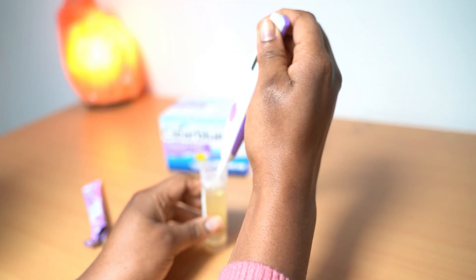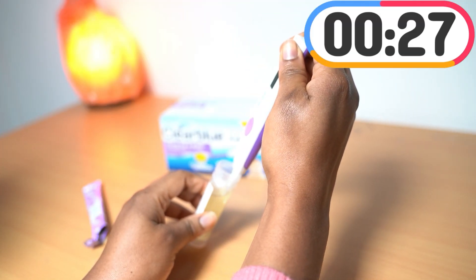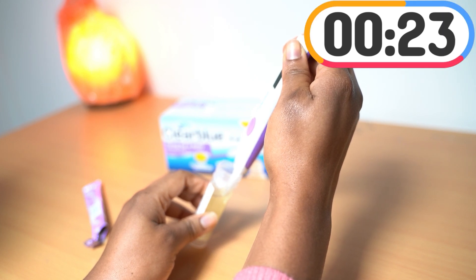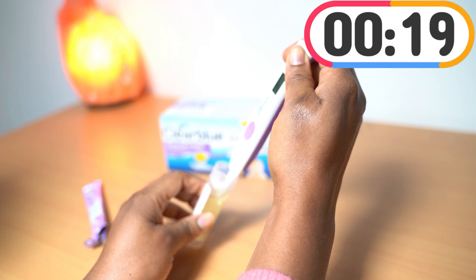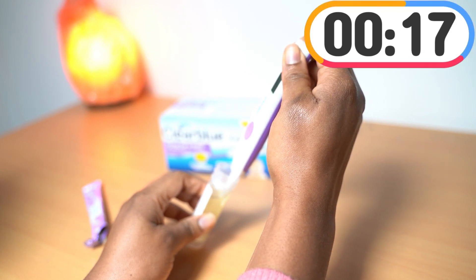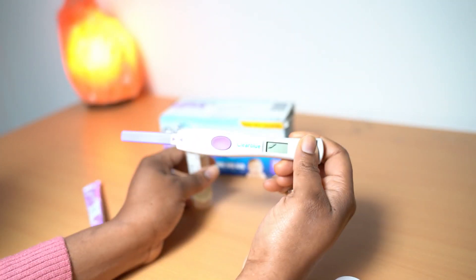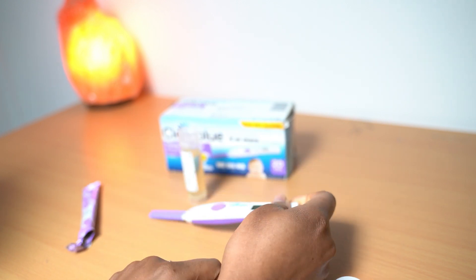Make sure when you dip it you count — one, two, three, four, five, six, seven, eight, nine, ten, eleven, twelve, thirteen, fourteen, fifteen. As you can see it's blinking — keep it down.